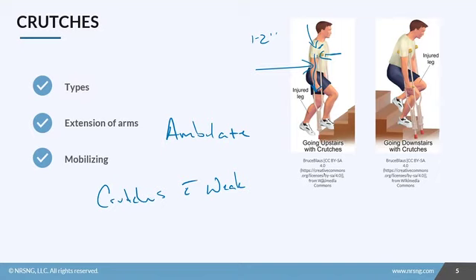The tricky part of crutches is going up and down stairs. When your patient is going upstairs, instruct them to use their strong leg first. So this is the guy going up first. So this is first. And then he's going to bring the crutches. He's going to stand up, and then the crutches go onto this. And then they stand, and you bring in the injured leg at the same time. And then it's the strong leg here, and he steps up. Once they're balanced, they can go one step at a time. Never let them go two steps at a time.